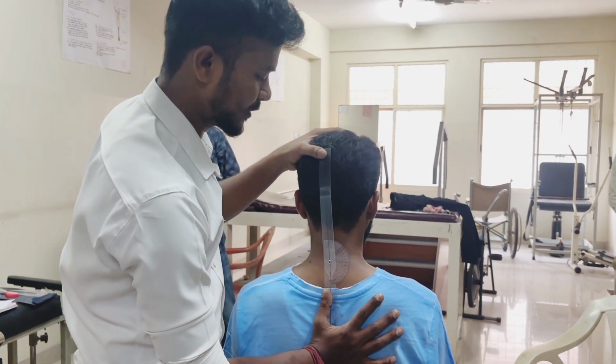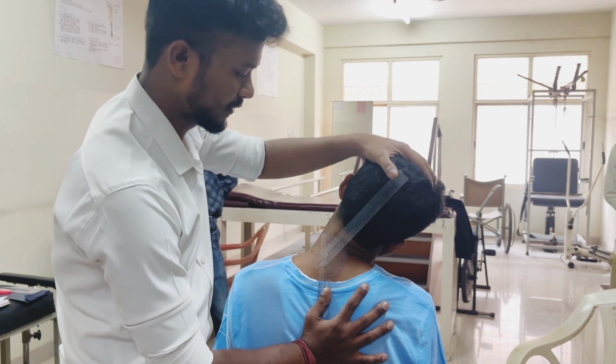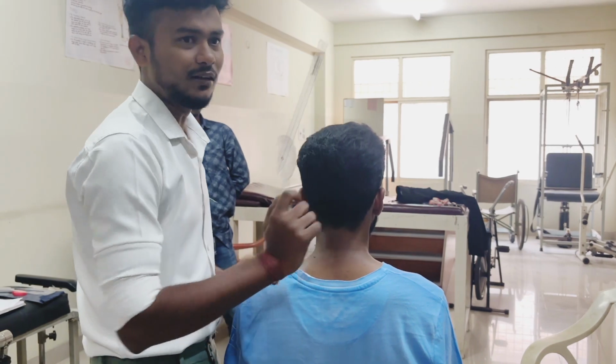Then we will ask the patient to do lateral flexion. Here we can measure our range from here to here. What is the range, we can measure. This is lateral flexion.